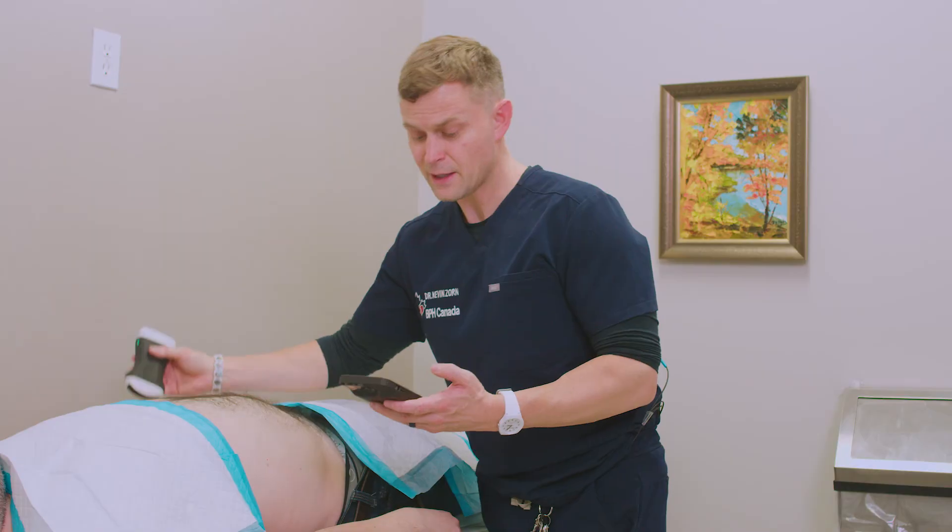That completes our examination of a gentleman's bilateral kidneys to make sure that everything's within normal limits, to add to the evaluation of microhematuria. Thank you.